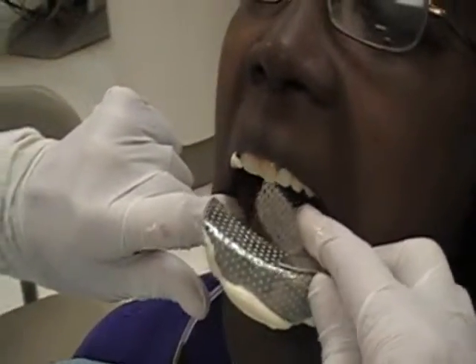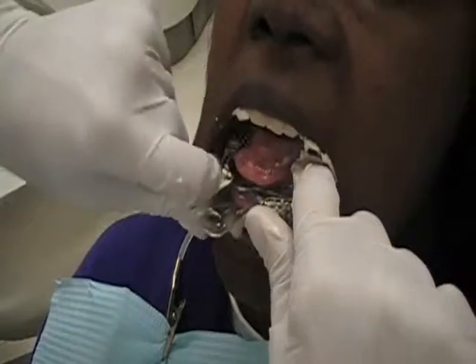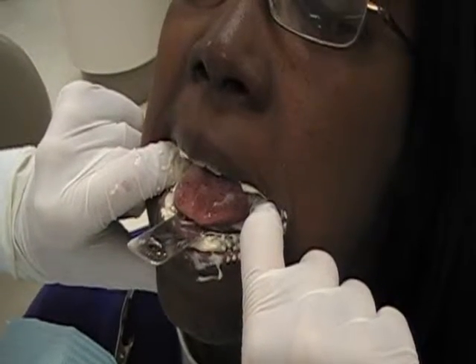Notice I'm going in from the side and then I place it — tongue up and out. Notice how I'm pulling the lip up and holding with these two fingers of each hand. Breathe through your nose.